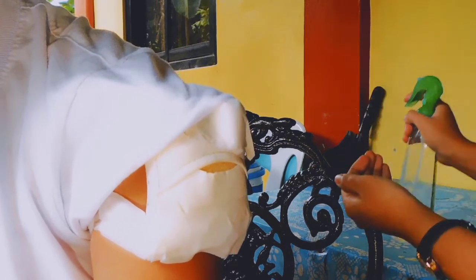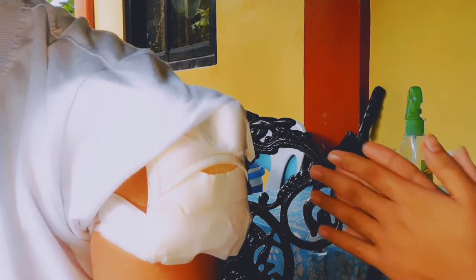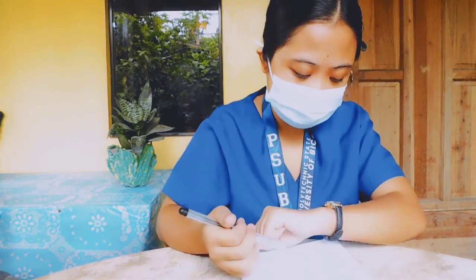Then take care of all of the equipment. Dispose of all of the syringes and swabs used. Thank you, ma'am. After all of the procedures, do not forget to document all of the relevant data: the dosage, the time, and the route of administration, and also the client's reactions to the medication. After that, assess the effectiveness of the medication.